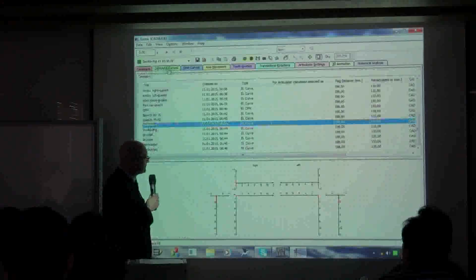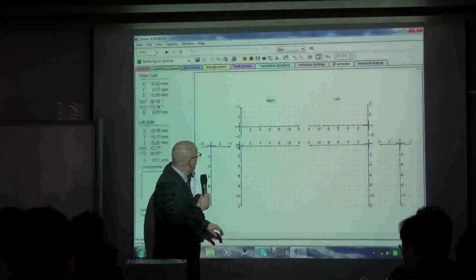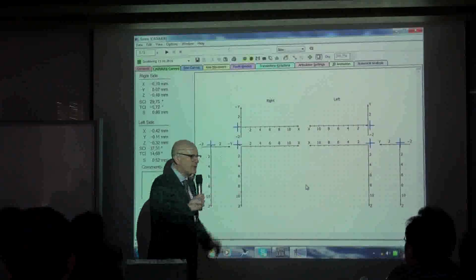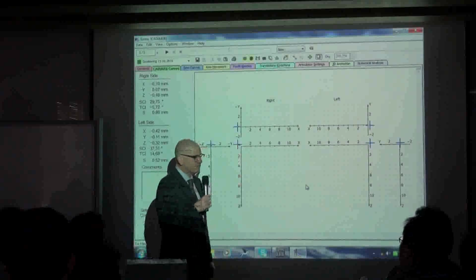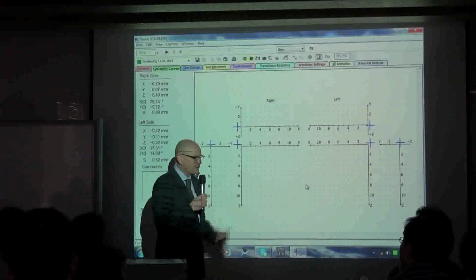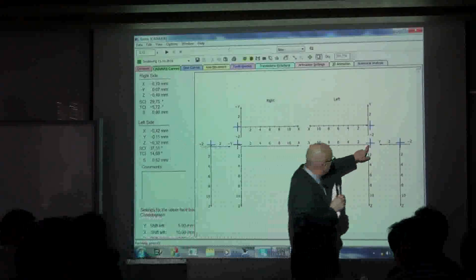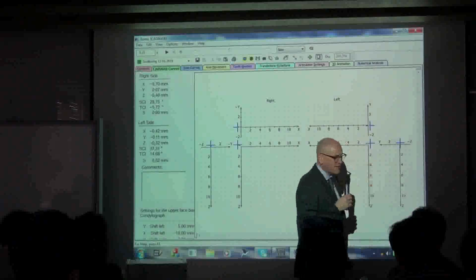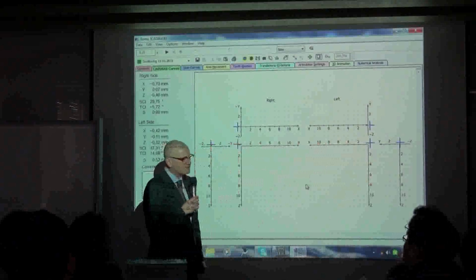Yeah, this one's good. Same. It's difficult to see. This is starting. When she's swallowing, she's going back as well, because she's avoiding front teeth. And because molar support is not 100%, she's going cranially at the same time. Very shallow infraocclusion in the molar region.